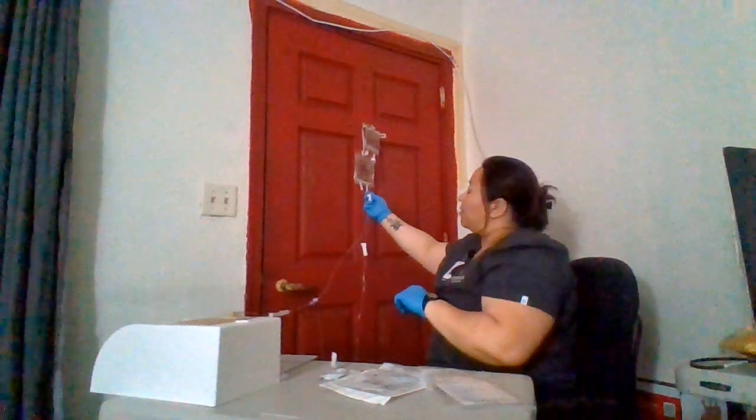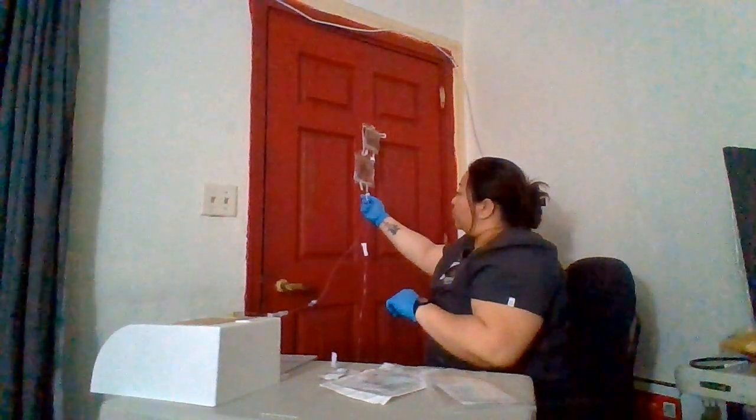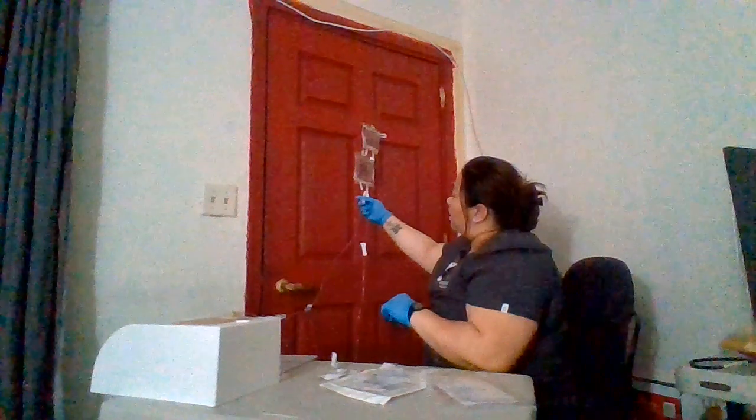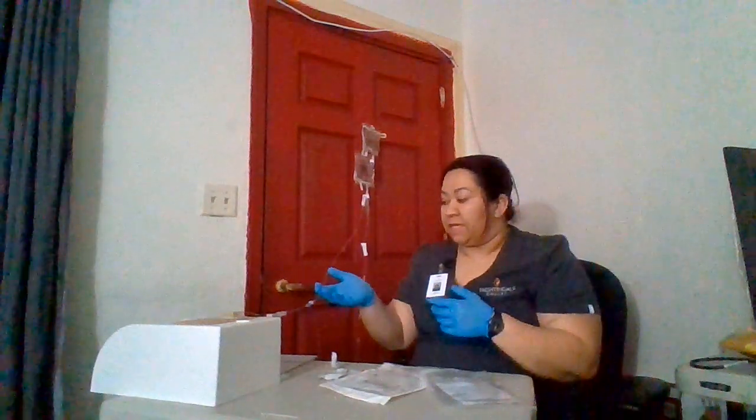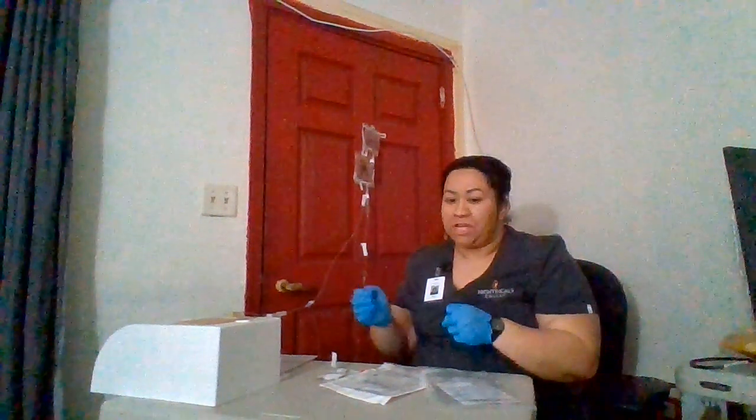It's been confirmed 100 drops per minute. And also again, due to demonstration purposes, I will be closing this tab. Okay. So now we have initiated the patient's medication.